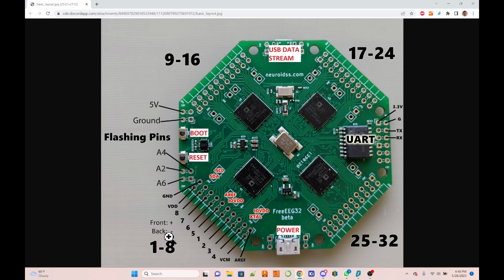And the locations of the channels, this image gives us a good idea, we just need a minor little bit of extra explanation.